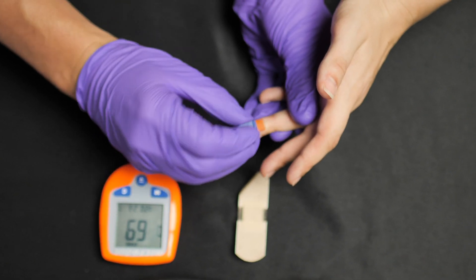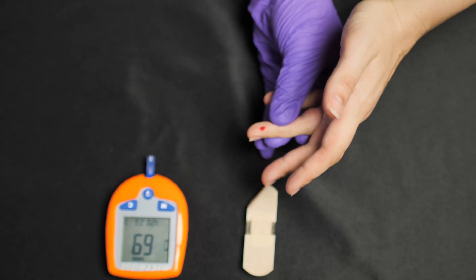Your blood is comprised of all sorts of different things inside it, and one of those things is glucose. When you eat sugars and carbs, those get broken down as sugars. The sugar travels through the bloodstream and goes out to the cells — all your cells need sugar. When we're assessing a blood glucose level, we will either take an IV start or do a finger prick. We're going to talk specifically about taking this from a finger stick, where we get a sample of blood and use a glucometer to figure out the concentration of sugar in the bloodstream.